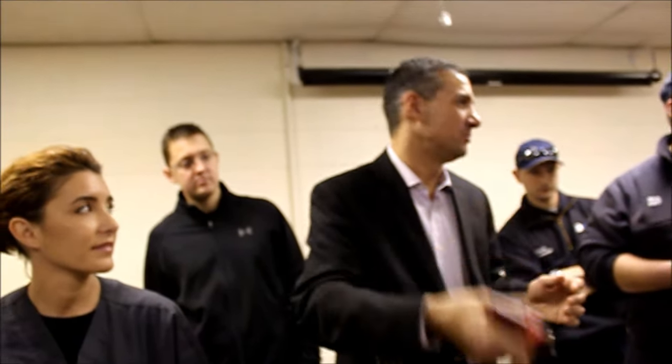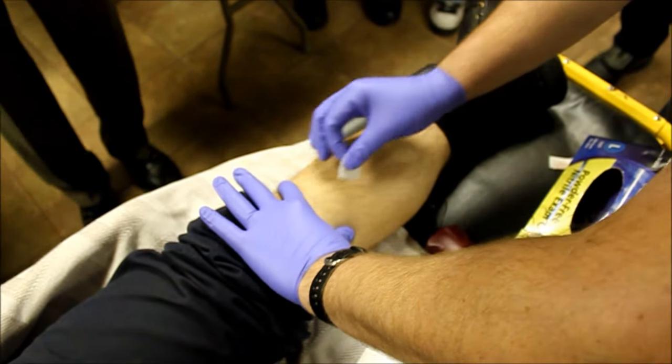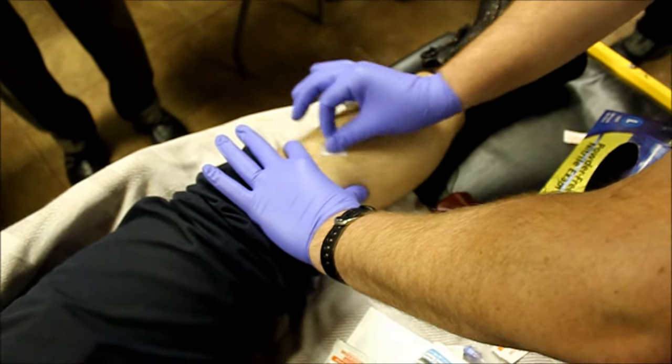Every time you play with it — boom, boom, boom. So it's 500 insertions. A little downtime between calls, drilling your partner — you just toss it and get a new one. So the drivers you're going to keep for a while. 500.